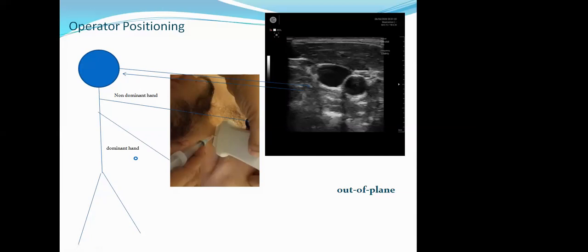And this type of approach is called the single operator technique, because the operator is also performing the procedure, and the operator is also looking at the screen. So this is easy because you control both the probe and the looking at the monitor.